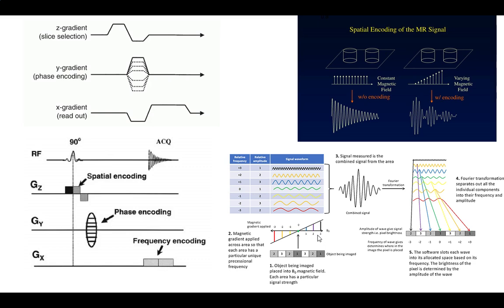So by shifting your B field with the gradient coil front to back, I have now adjusted the dephasing speed, and it is linear with the B field. So it's a fairly nice, simple one to do. Does that all make sense? Yes, I think the Y is starting to make more sense, which is good.